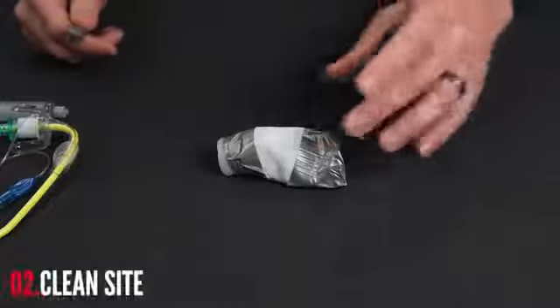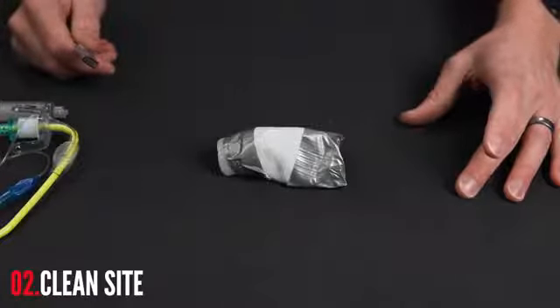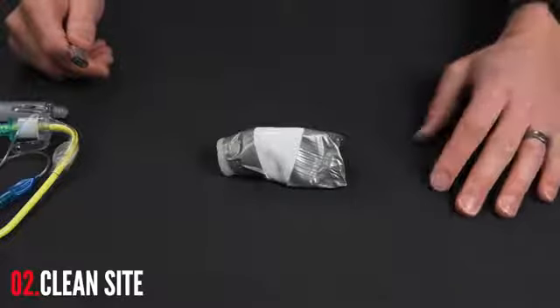Textbooks will tell you that you're going to want to sterilize the site here. In my experience, if you're performing this procedure, an infection after the fact is kind of the least of your worries. You're just trying to get that airway.